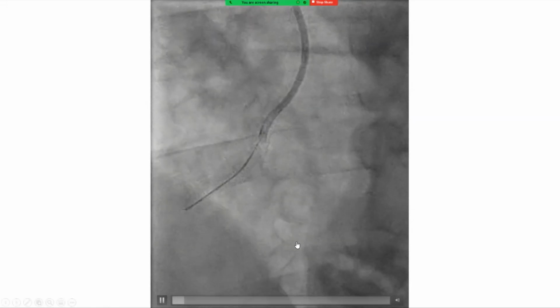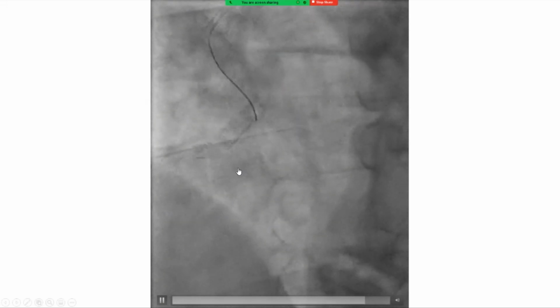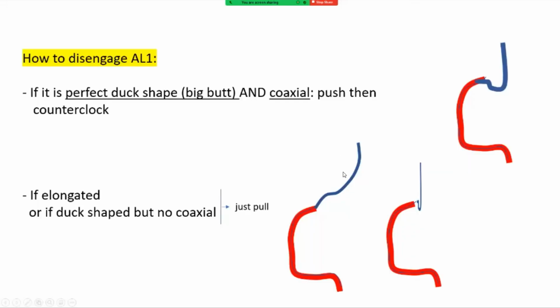This is a case where the Amplatz left was elongated, somewhat deep and elongated inside the coronary. It wasn't duck-shaped. In that case, just pulling it worked to disengage it. We didn't need to do what we did here, push and torque out. Okay? So it was elongated, we just pulled it. Same if you're duck-shaped but not coaxial. You can also typically pull it.